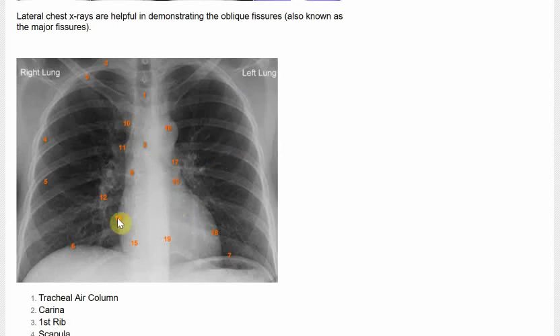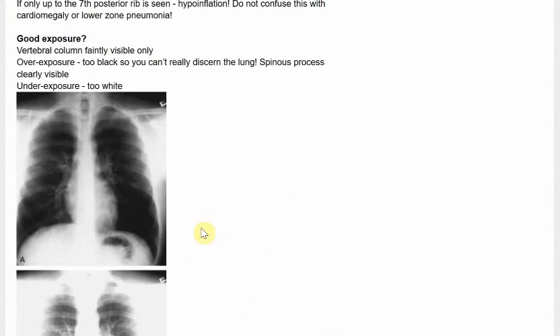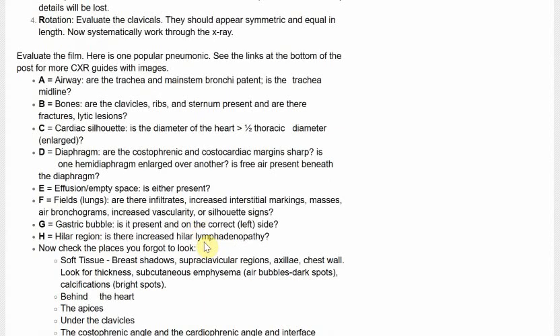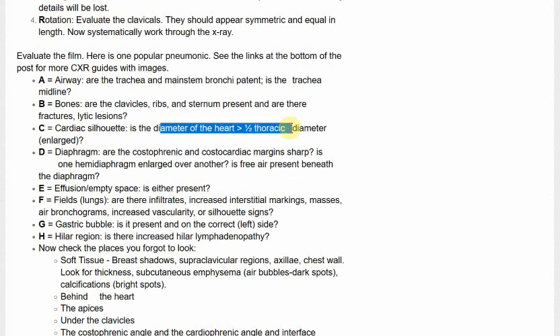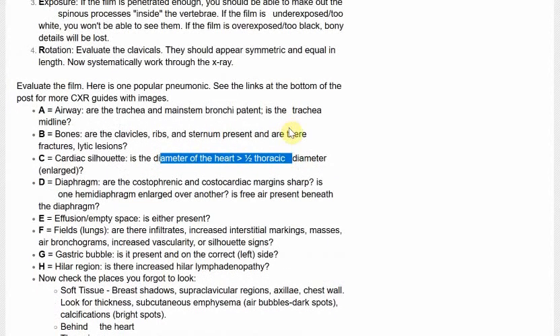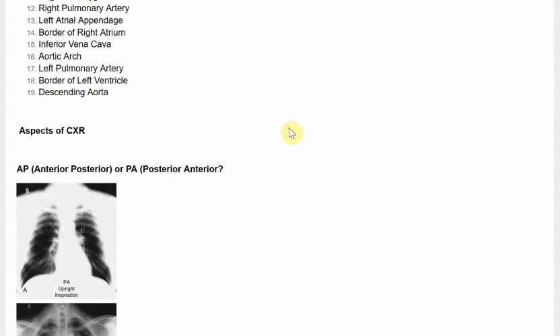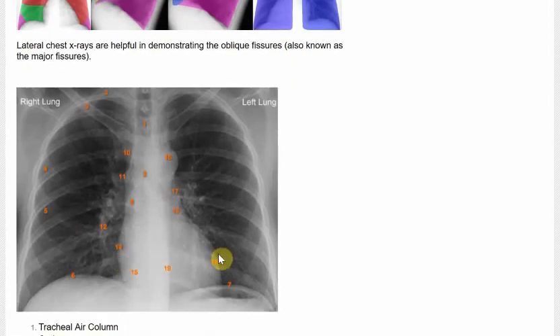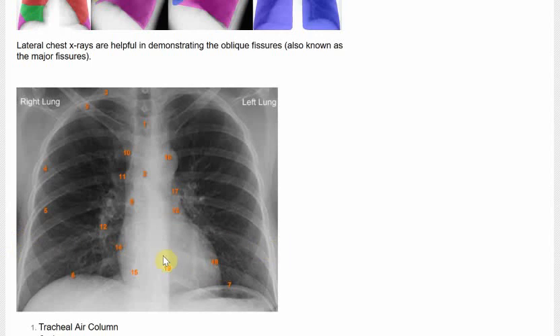C is for the cardiac silhouette. Your cardiac silhouette is there — you don't want it too big. When it's too big, it could mean heart failure. The diameter of the heart should not be more than half of the thoracic diameter. When that occurs, there's cardiomegaly. So how do you do that? You measure the distance from one side of the heart to the other, and if that distance is more than half of the total thoracic width, then there's cardiomegaly — it could be heart failure.